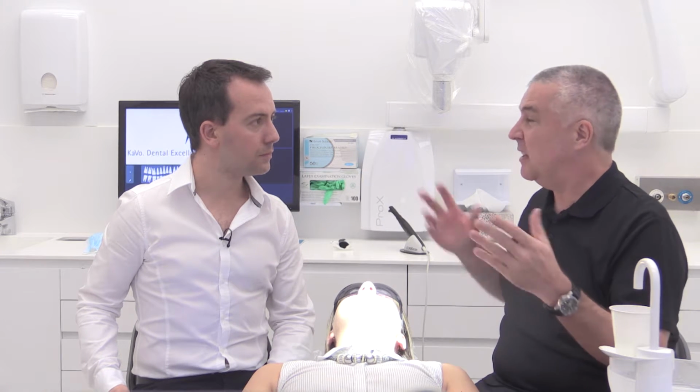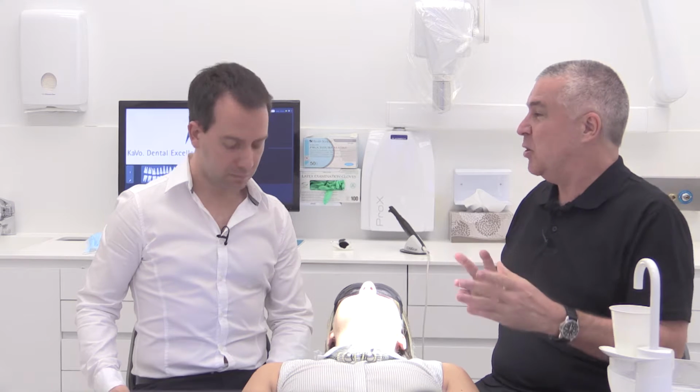Some research which was done by our Centre for Paediatric Dentistry found that if people weren't taking bitewings of children, they're actually missing a very large portion of the caries. Bruce Newman led a study which did exactly that. And of course, there's this natural reticence amongst people to take radiographs in children because they don't like doing it and they find it difficult to talk to the parents about it. So a device which can not replace radiographs but can get you that information that you need, I think is really useful in paediatric dentistry.